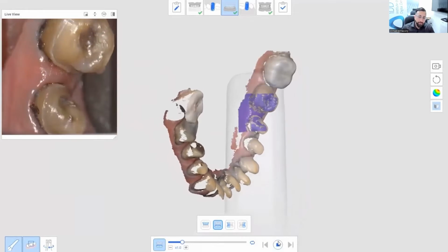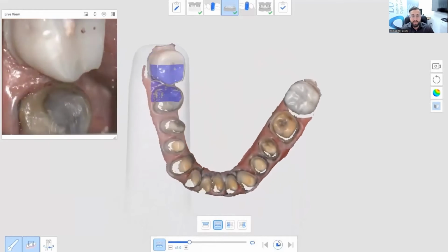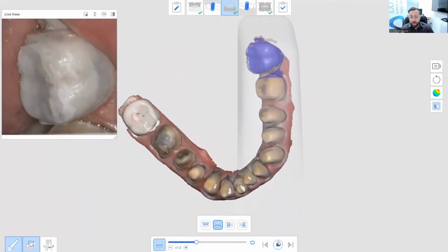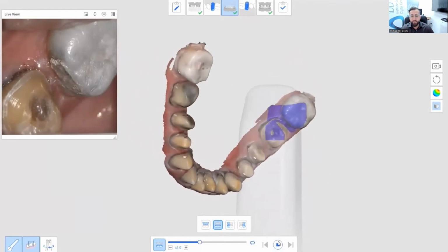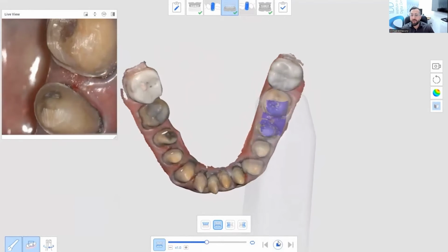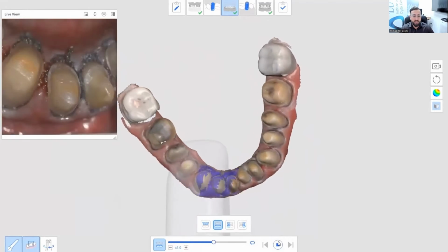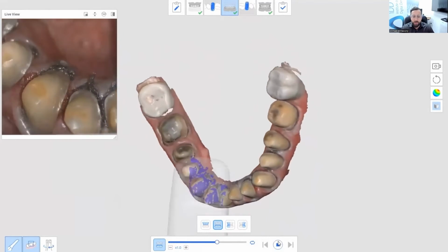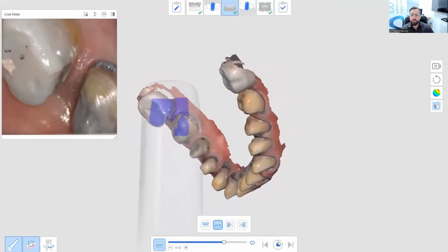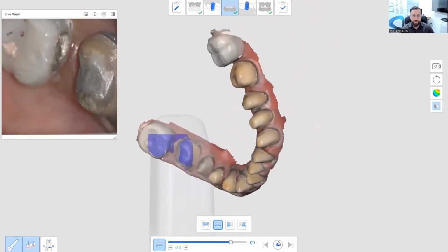And this is a full mouth rehab case being scanned very simply. And I can tell you, taking an impression of this case would be much more difficult. An impression of 12 crowns is not an easy feat. Whereas when you use a scanner, it is much easier, it's much more efficient. And this is really where the ROI comes from, because you are just making your clinical processes much faster, much more relaxing, easier on you, easier on the patient. Because I know you all can imagine, if you try to take an impression of this, if you miss the margin in one of these crowns or you have an air bubble, how frustrating that is. You have to redo the whole thing.